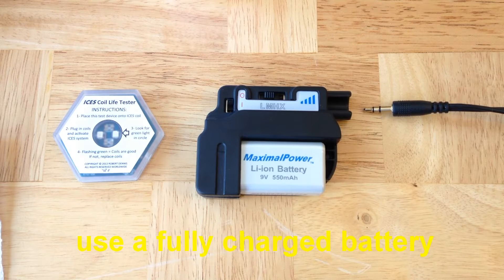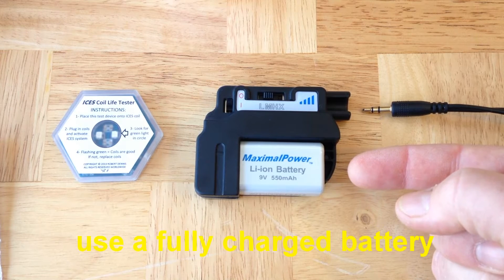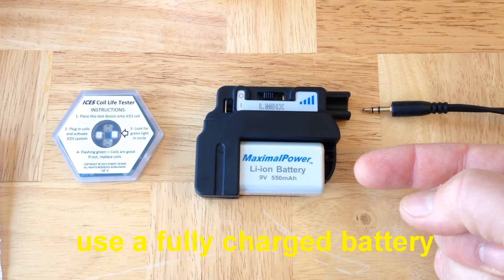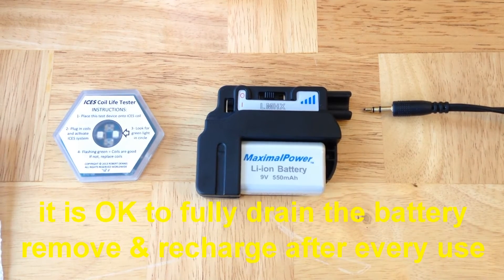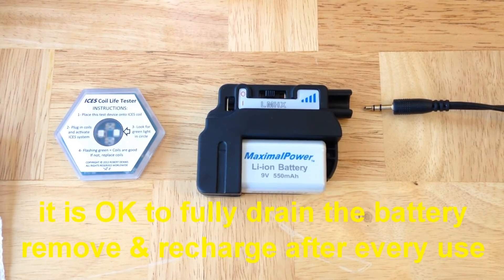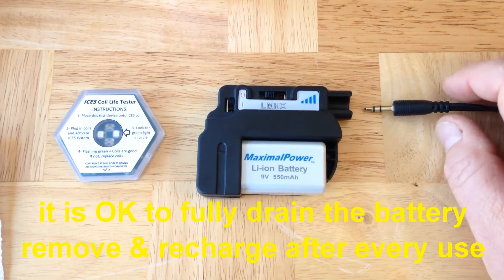The first thing you always need to do is use a fully charged 9 volt battery in systems that have removable batteries. We recommend the use of Maximal Power from Amazon.com. It is okay to allow the 9 volt battery to run until it's completely drained. Once drained, you should remove the battery and recharge it immediately.